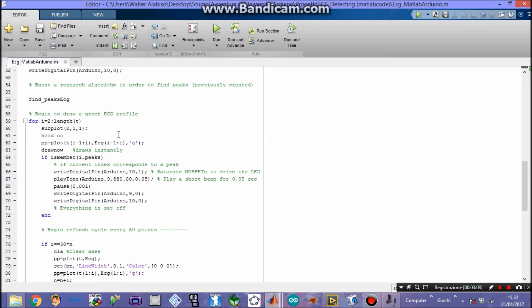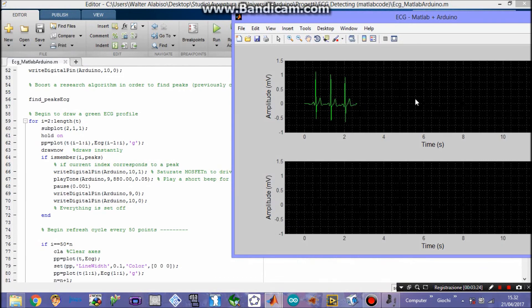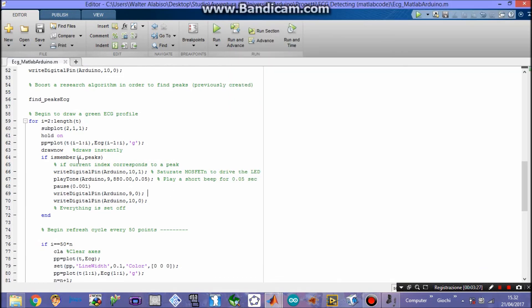Then we need two for cycles. The first one will plot in green our ECG dot by dot and it draws instantly, so we continuously see the ECG going as the time goes by. Then if our current index corresponds to a peak found before, we need to switch the transistor on — so we write a digital high, logic 1, on pin 10. This will turn the LED on. Then we play a small tone on pin 9; this is the frequency, you can choose whatever you want, for this duration. Then a little pause before setting everything off again.